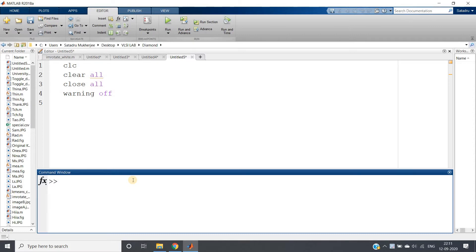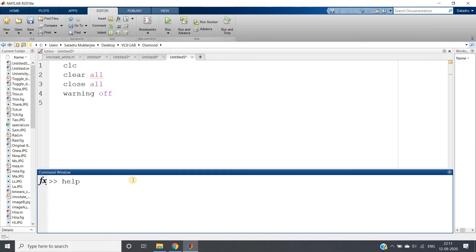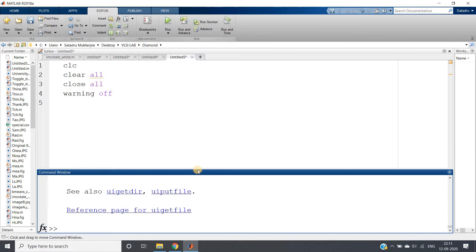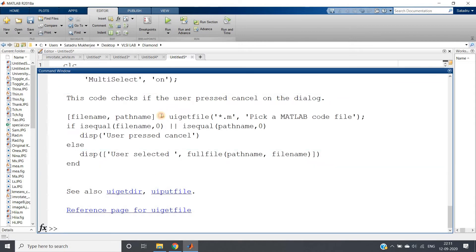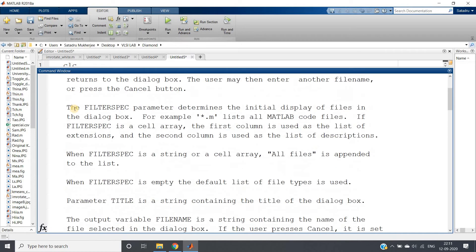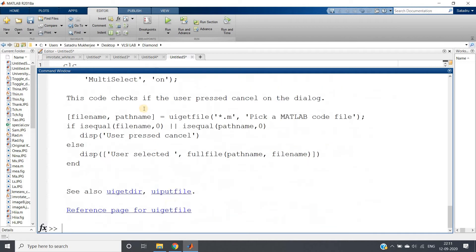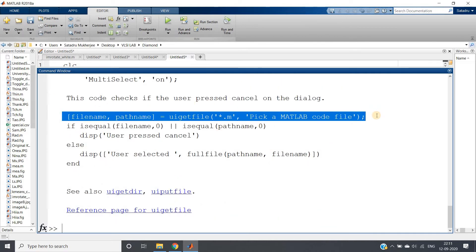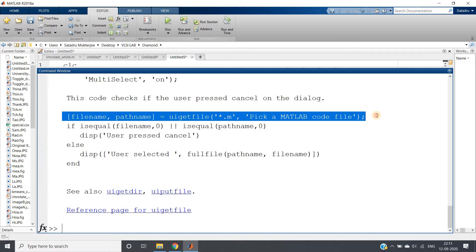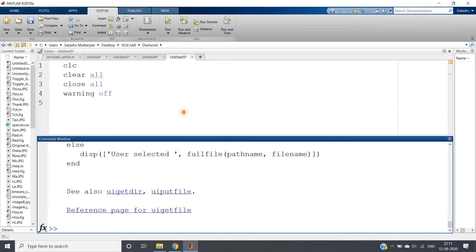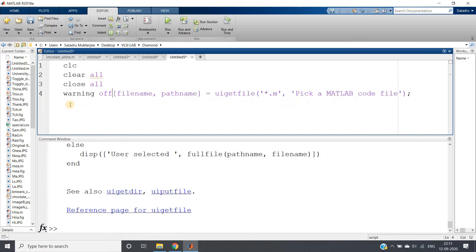So first of all we will not specify one particular image. What we want, we want user will select image from anywhere in the local system. Okay so for that I will write help uigetfile. This is the function user interface if I want to get file then this is the command. If you go below here you will be getting one piece of code, let me just copy this one. Ctrl C, Ctrl V. In engineering many times you have done this, no problem.